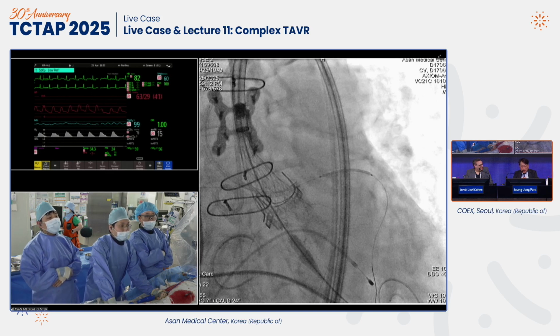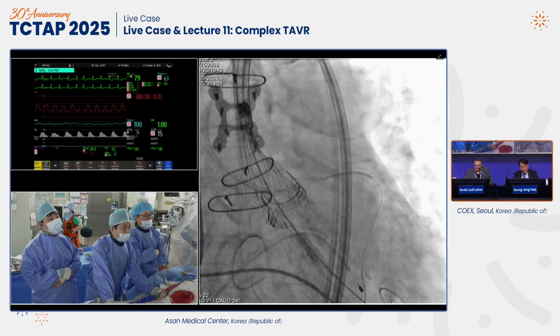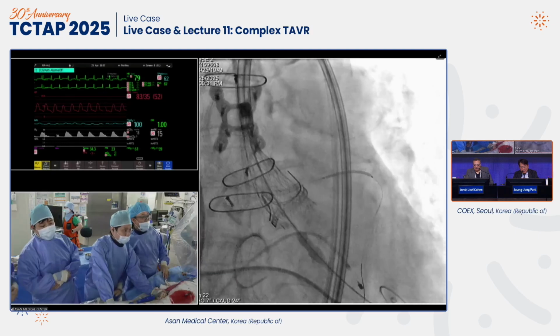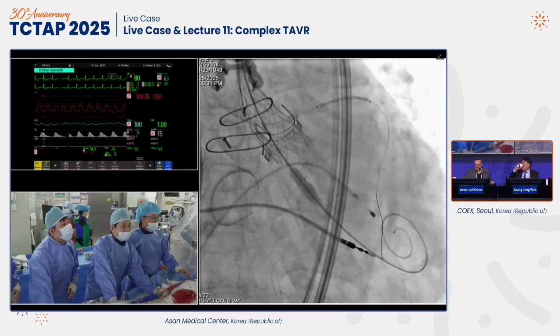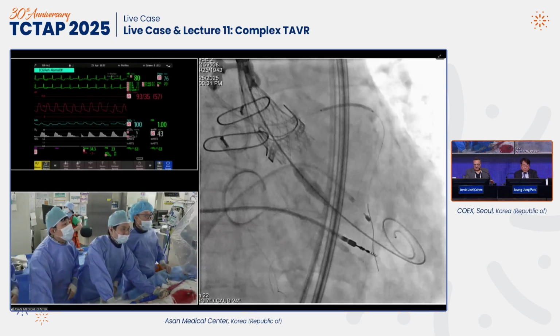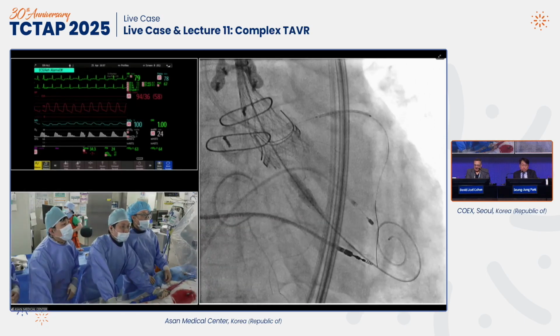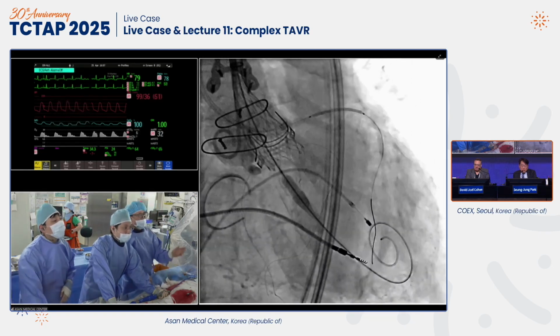However, the surgical valve has already protected the sinus and the coronary ostial part, so don't worry too much about it. Let's take another shot. No, absolutely. Do you think it's much different compared to the previous one? No, not much. Let's take one deeper shot. I think it is. I think now it's really good. Yeah, the depth is perfect. Good. And I like it.